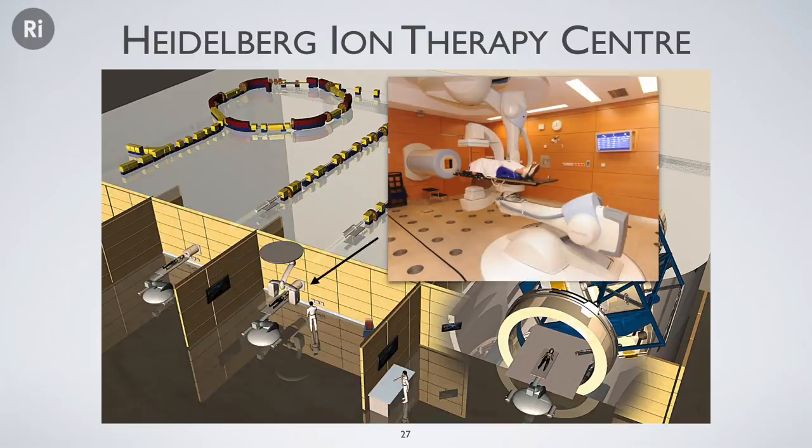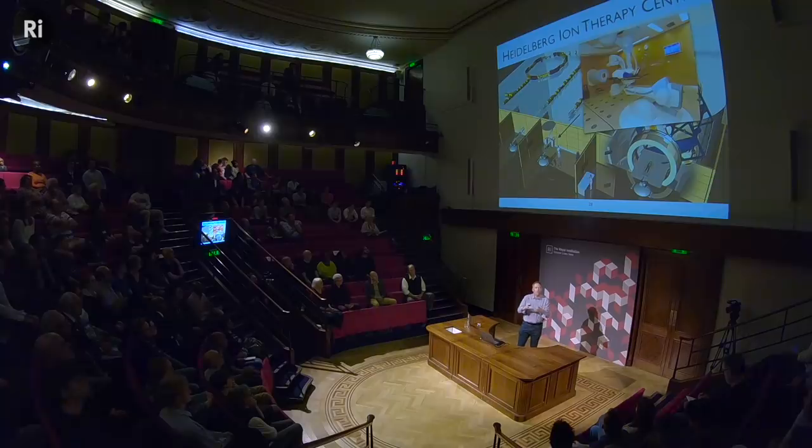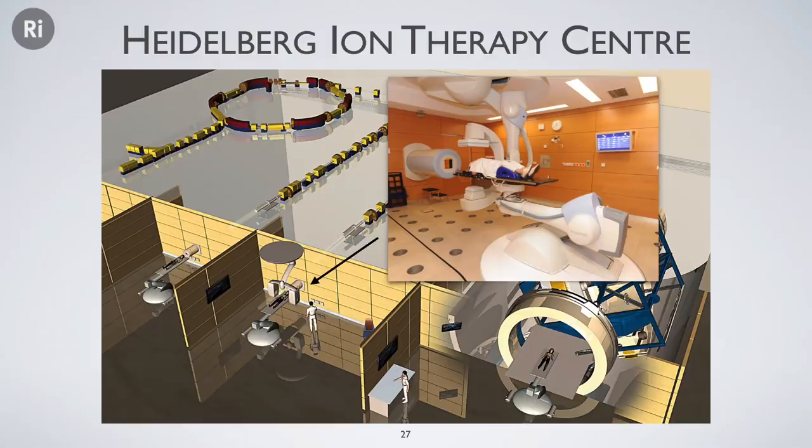Now, at this point, the technology starts to diverge a little bit. Because at a certain point, it's no longer just a particle accelerator for its own sake. You have to treat a patient. And at the end of these beam lines, now you have treatment rooms. And you start to see things that look much closer to the radiotherapy treatment room that I showed you pictures of earlier. So in this case, you have a single fixed beam line that's coming in through the wall, and then the patient on the same robotic couch, instead of that couch being mounted to the floor, it's actually on a robotic arm, so you can position the patient wherever you want them. That C section that you see, that's actually a CT scanner, so that allows you to take X-ray images all the way around the patient.